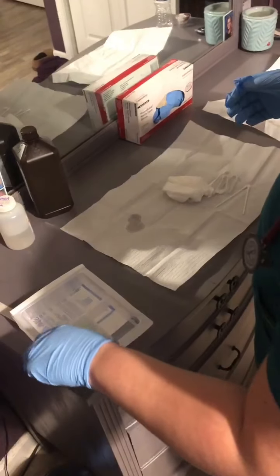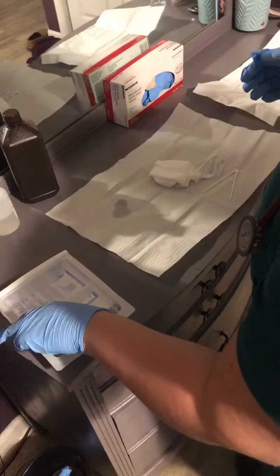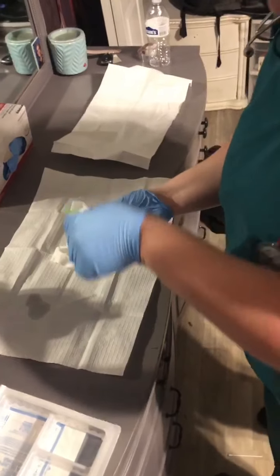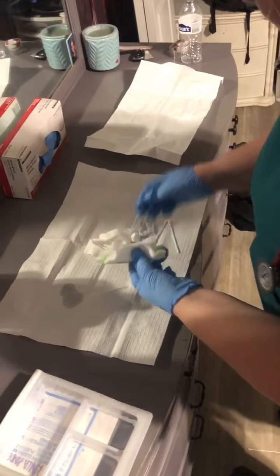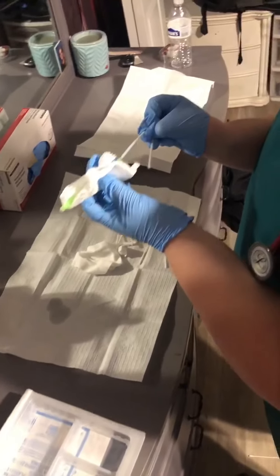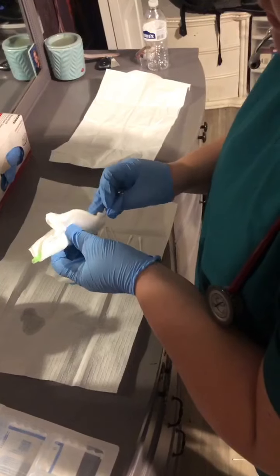So this I can throw away. I'm going to take this and dip it in the normal saline and get it all cleaned off. Then I'm going to take one of my 4x4 gauzes and my pipe cleaners, and I'm just going to clean through and make sure that it's dry all the way through.